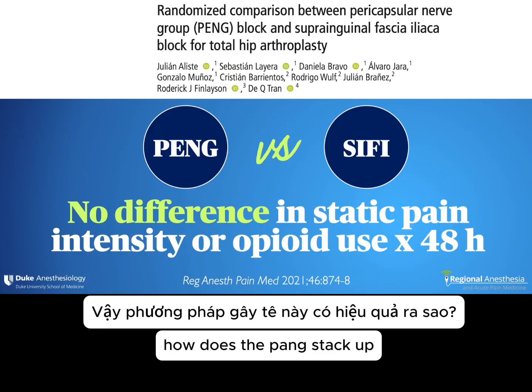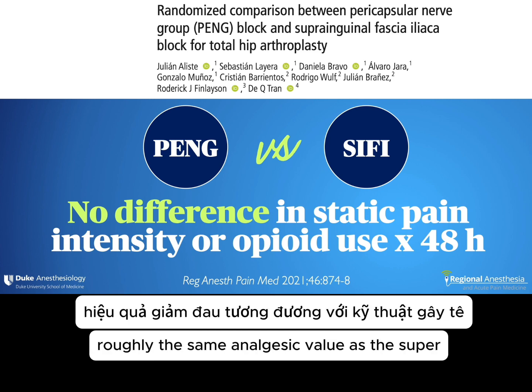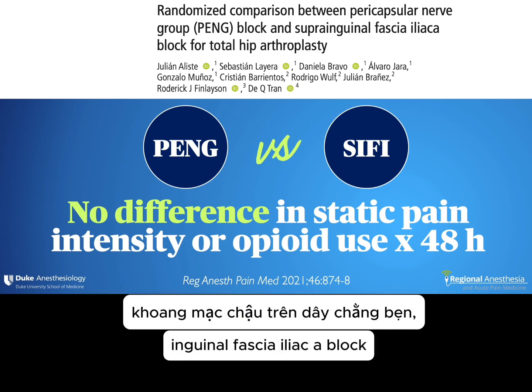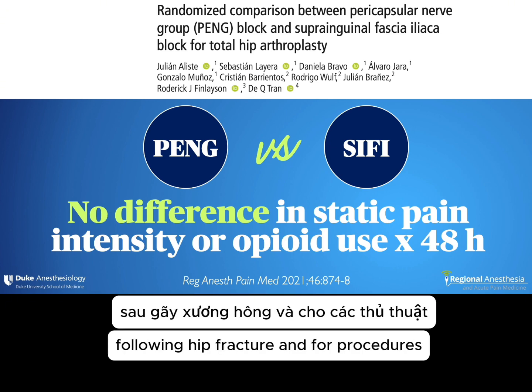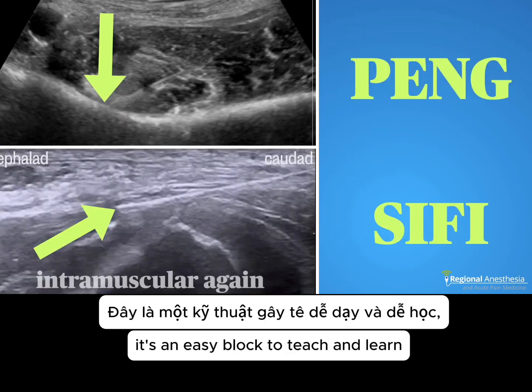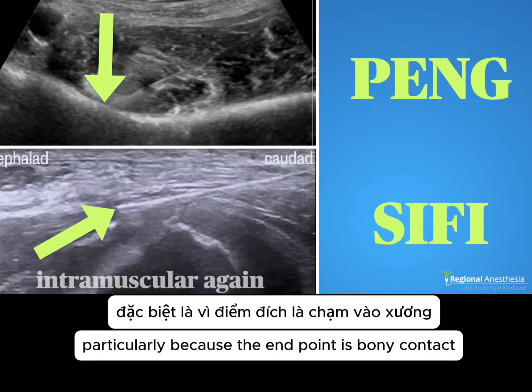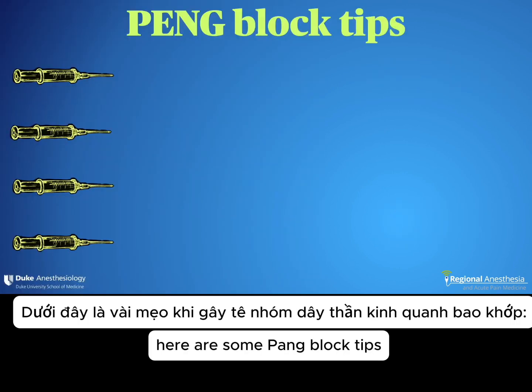How does the PENG stack up? Well, while it's a relatively new technique, it seems to provide roughly the same analgesic value as the suprainguinal fascia iliaca block, making it an attractive option for analgesia following hip fracture and for procedures such as hip arthroplasty and arthroscopy. It's an easy block to teach and learn, particularly because the endpoint is bony contact rather than a nuanced intermuscular fascial plane. Here are some PENG block tips.